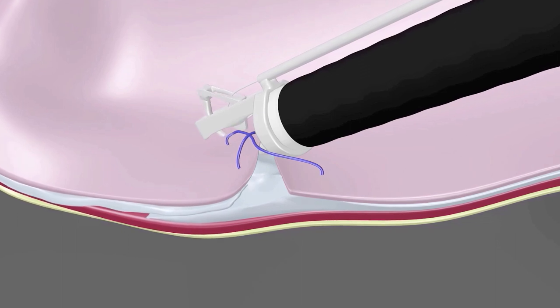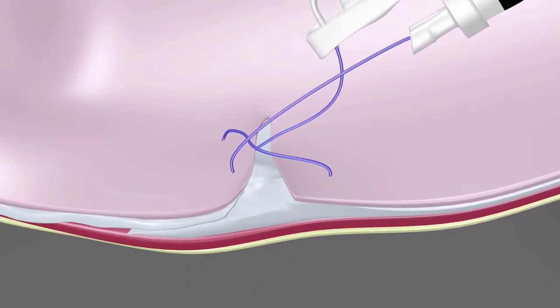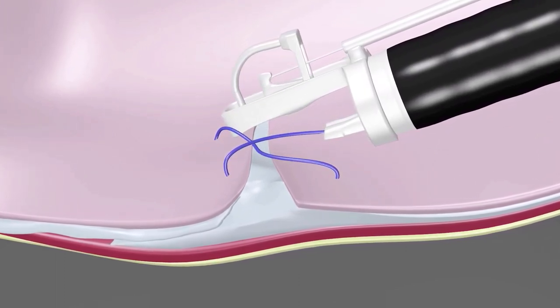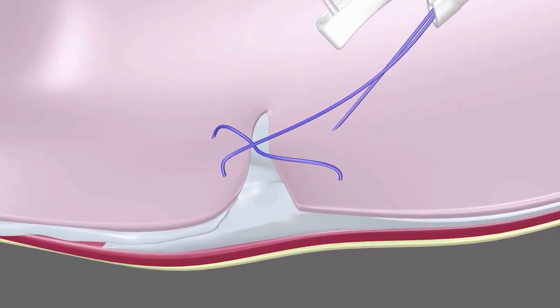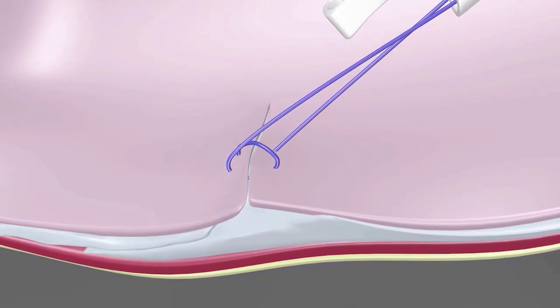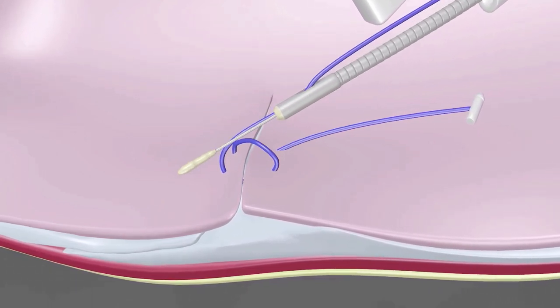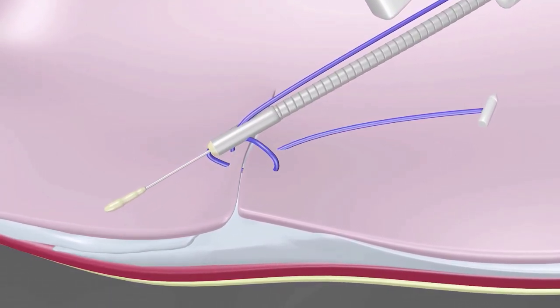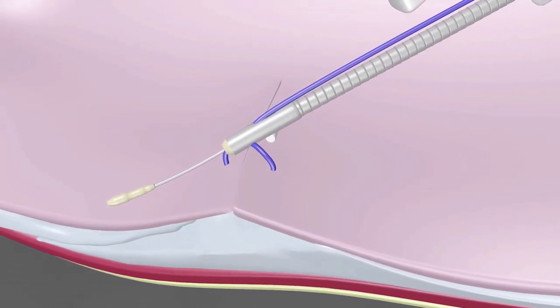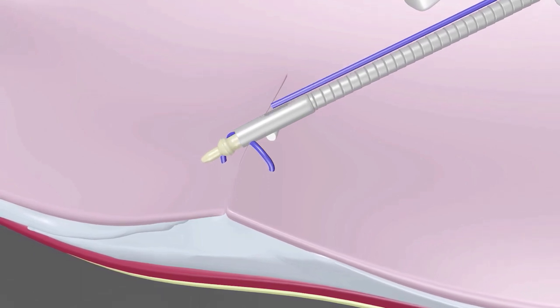You may also consider using hemostatic clips to close the defect. However, we prefer suturing for stomach closure. After the last stitch, the needle is released and serves as a tissue anchor. Gentle tension is applied to the suture to oppose the margins of the defect. The suture is then secured and cut using the cinch device.